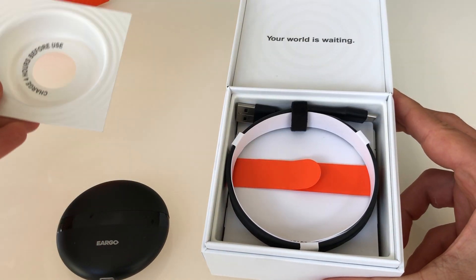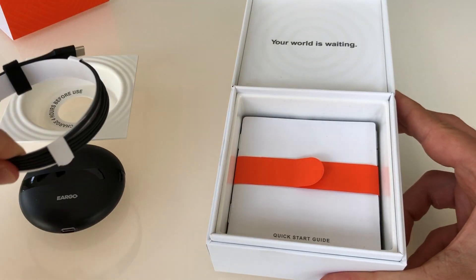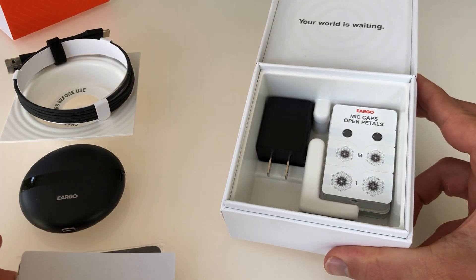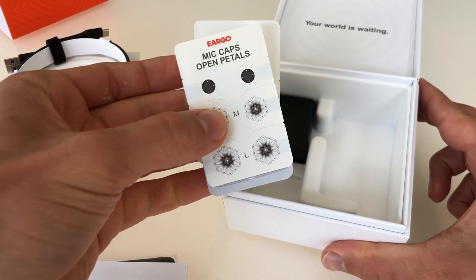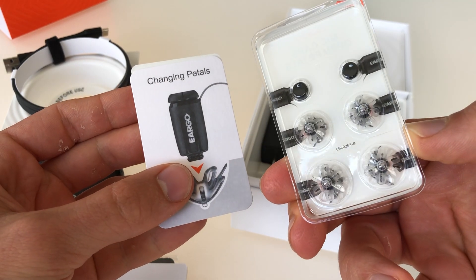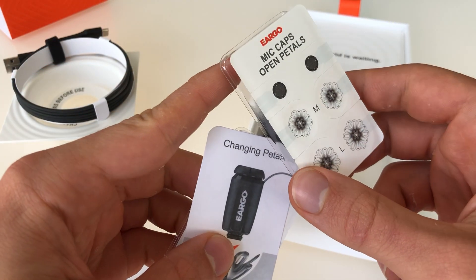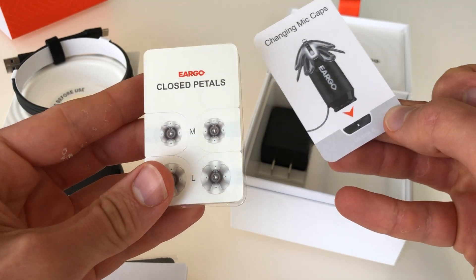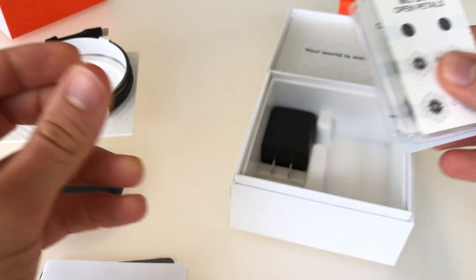Opening up the box here, we have a cable for the charging system, we have a quick start guide, some mic caps — these are to be used over the microphone ports. You can see there, as well as the rubber tips, the piece that goes in the ear for medium and large sizes, and some instruction about how to change them, and different size rubber tips that go in the ear based on what you need.